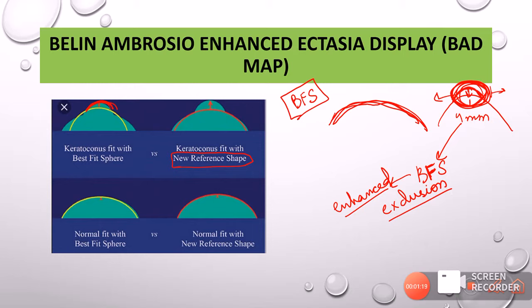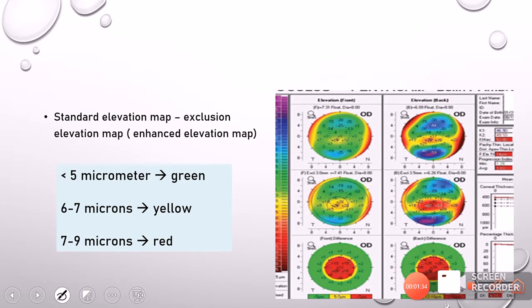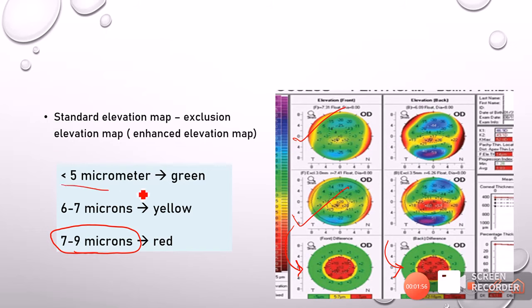This is the concept of the BAD display — the Belin-Ambrósio Enhanced Ectasia Display — because we are enhancing the best fit sphere and getting the elevation map in such a way that even minor keratoconus becomes more obvious. We calculate the difference between the standard elevation map and the exclusion elevation map. A green zone is good, yellow is intermediate, and red is severe and dangerous. Less than 5 micrometers difference is green; 6 to 7 is yellow; and 7 to 9 micrometers is red — very risky, indicating the patient may have ectasia.